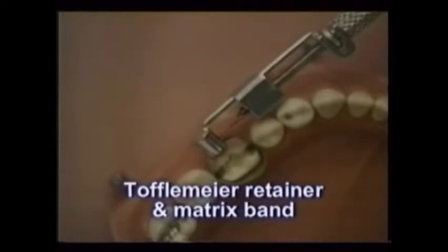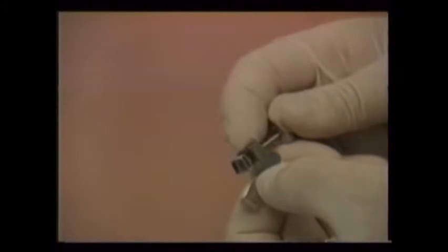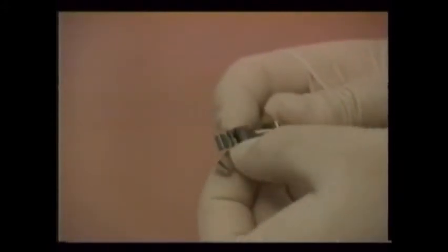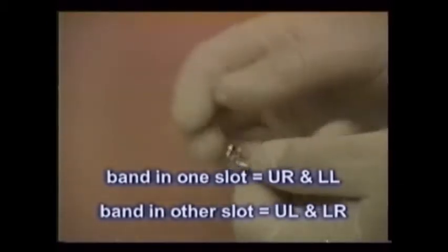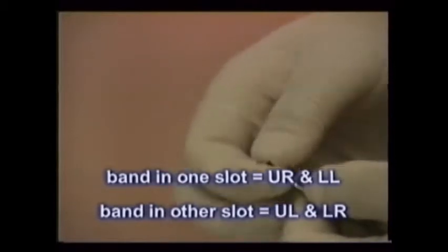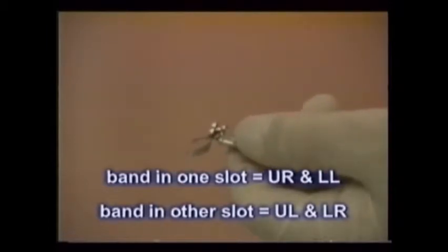The reusable Toffelmeyer retainer and a disposable metal matrix band act as a temporary wall holding the soft class II filling in place until it sets. Straight bands like the one shown are used on premolars, while bands with contours are used on molars. Though seemingly complex, the assembly becomes automatic with practice. Notice how flipping the band from the slot on one side to the other determines where it will work in the mouth, whether on the left or the right.